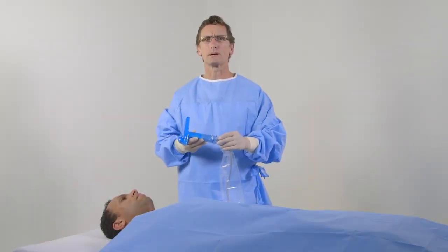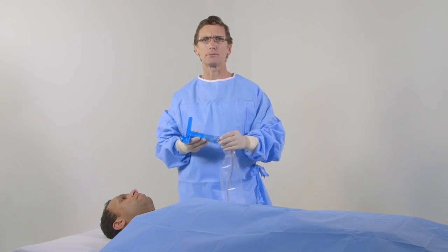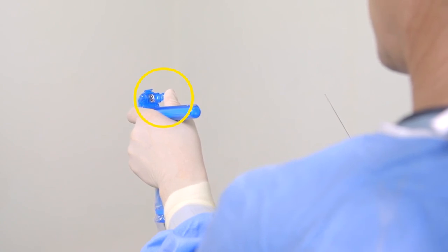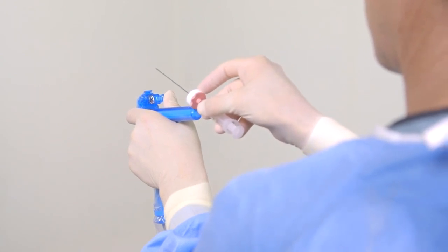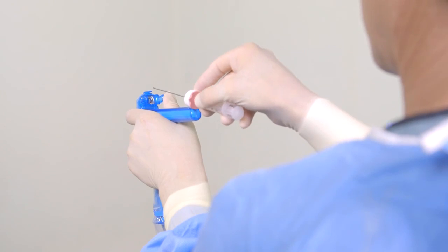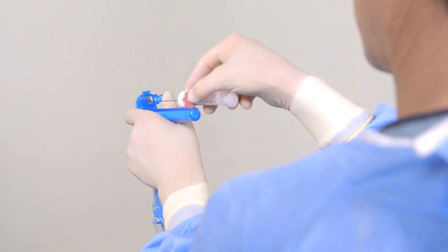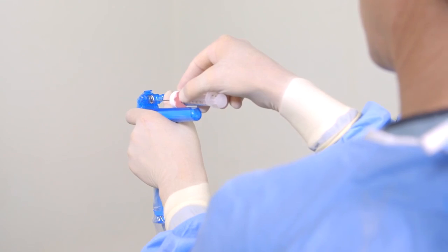To begin a procedure, assemble the transducer and sterile shield from the AxoTrack 1 procedure kit and preload the needle into the integral needle guide. Start preloading the needle by rotating the needle clamp fully forward with your thumb to the open position, such that the needle guide opening is unobstructed. Then, place the magnet against the proximal end of the magnet rail to stabilize the needle as you move the needle tip into alignment with the needle guide opening. To maintain needle sharpness, avoid hitting the needle tip against any surface as it is preloaded into the needle guide.